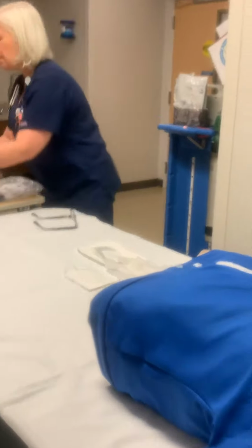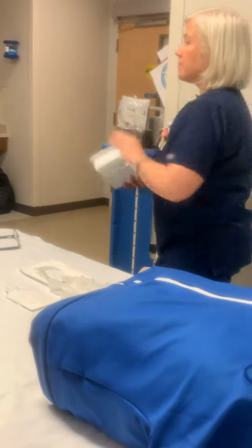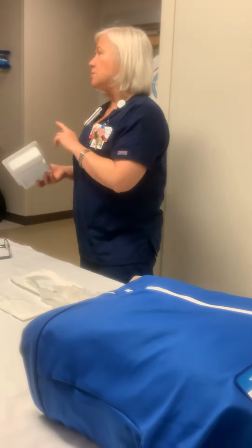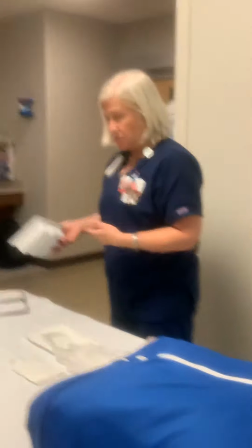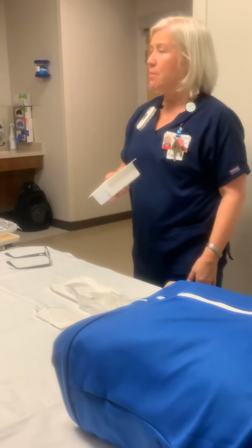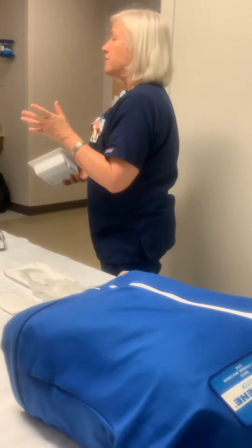Trach care, just if you have to do the cleaning. Trach care here real quick. The one thing here at Banner Gateway, it's both nurse and respiratory that takes ownership of the trach. In other facilities, a lot of times it's respiratory, and in some other facilities it's nursing. It's pretty well spelled out in the policy, but at Gateway it's a shared responsibility. It has to be done twice a day, or more frequently if it's soiled.